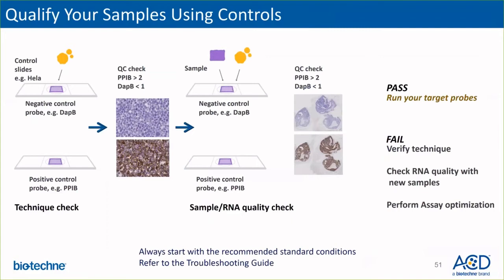Before we move forward, I would like to reiterate that it is critical to qualify your samples using control probes before running the assay using the target probes.